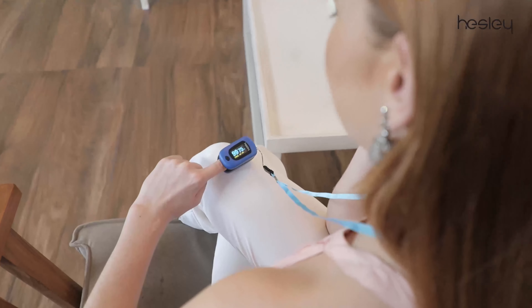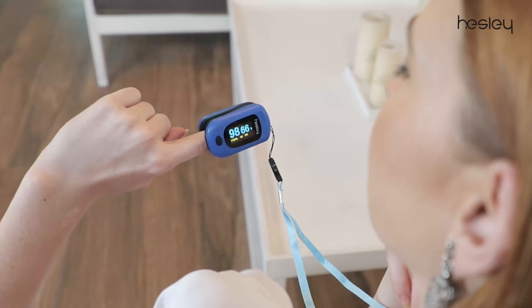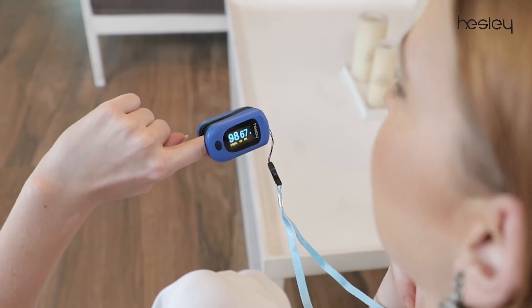It's a simple and effective device to measure your pulse rate and levels of oxygen in your blood, also known as SpO2, through your finger at home, clinic, or anywhere.